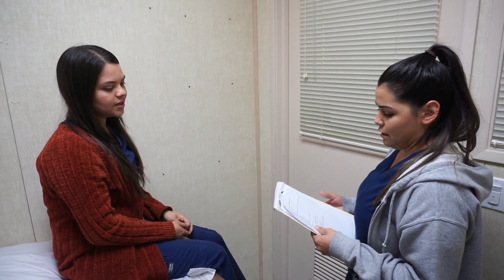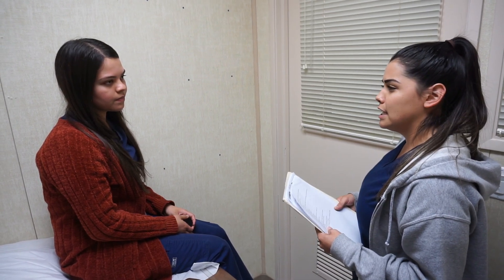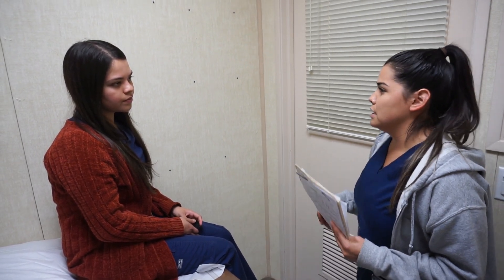Hi, Jasmine Garcia? Yes. My name is Ruth and I'm Dr. Smith's MA. Can you please verify your birth date? Yeah, it's 2/19/99. Okay, are you fasting? Yes. Okay, are you allergic to any latex? No. Okay, are you taking any blood thinners? No. Okay, I'm going to be taking your blood draw today, okay? Okay.